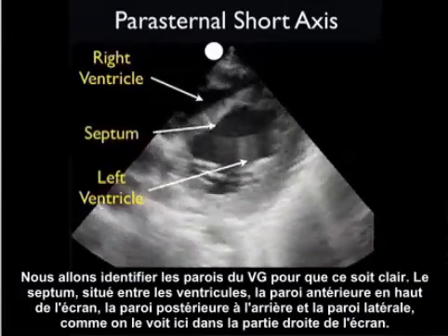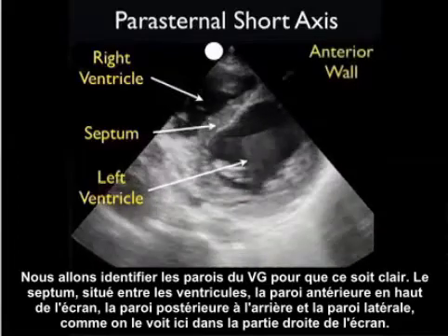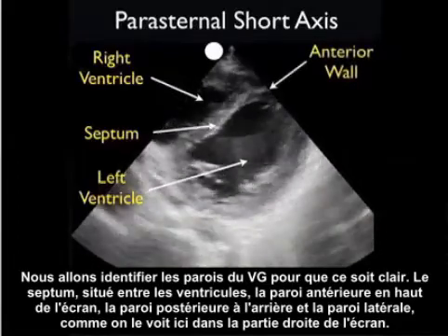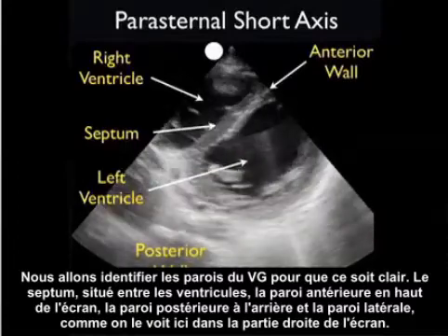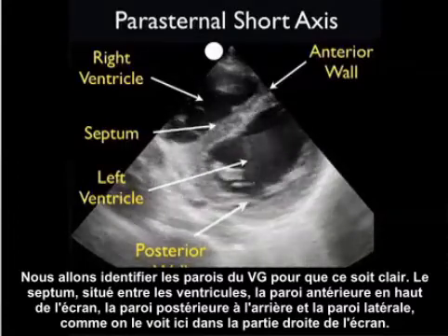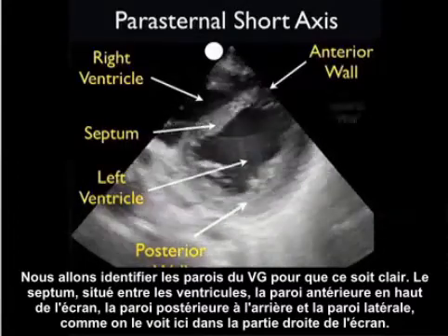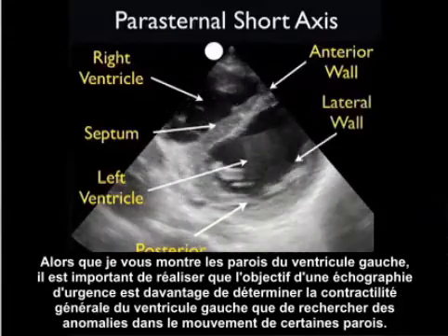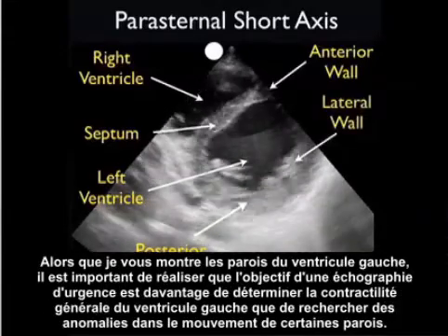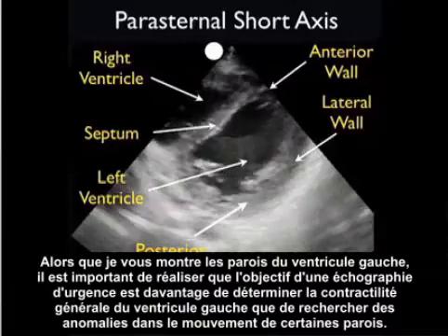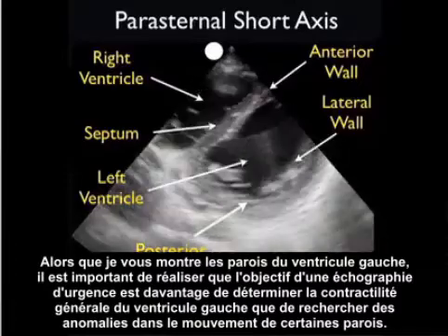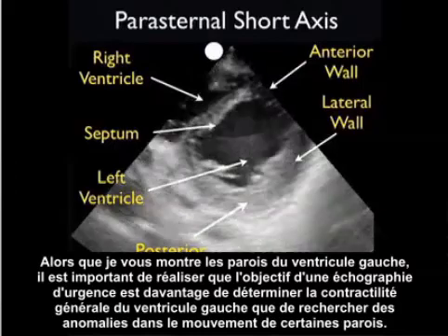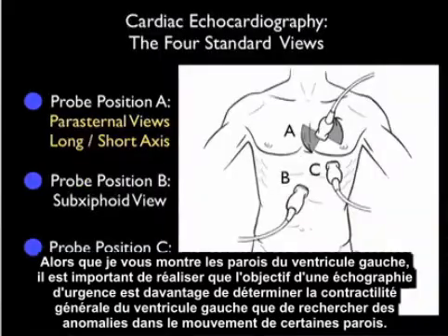For learning purposes we'll identify the walls of the LV: the septum in between the ventricles, the anterior wall to the top of the screen, the posterior wall to the back, and the lateral wall towards the right portion of the screen. While identifying these walls is useful, the goal of emergency echo at the bedside is to determine overall left ventricular contractility rather than looking for segmental wall motion abnormalities.